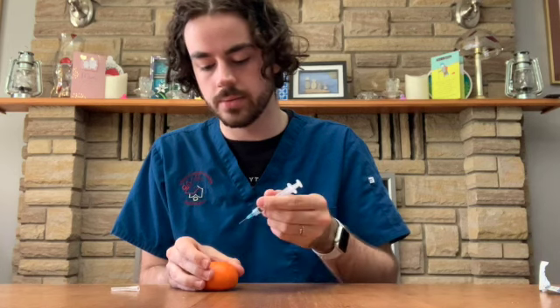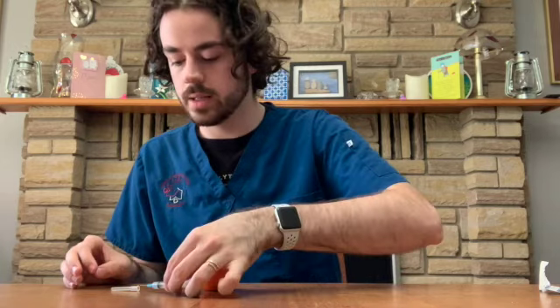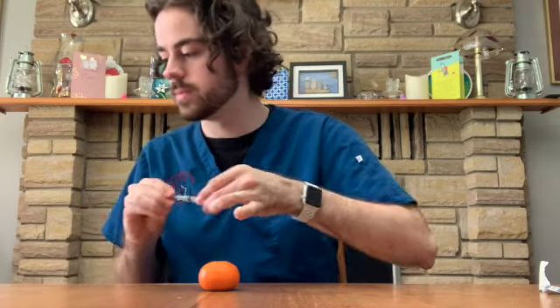and take the needle out. I can then recap my needle and dispose of the whole syringe in the sharps container. Afterwards, I would not rub or massage the site because that will interfere with medication distribution and absorption.